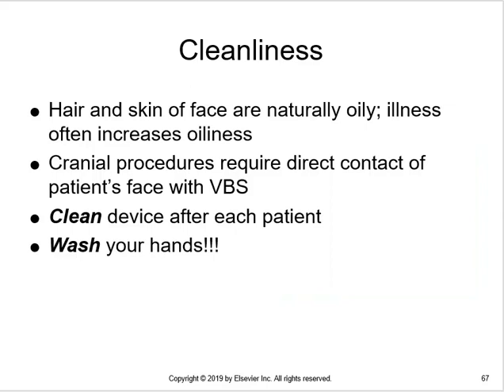So, cleanliness. Hair, skin, face, lips, mouth, nose are especially oily. And people know that. Some of the projections and positioning that we're going to use, we're going to put the patient's mouth directly in contact with the image receptor. For some of the projections, you use the acanthomeatal line and put that perpendicular to the image receptor, so their mouth is millimeters away from the image receptor at best.